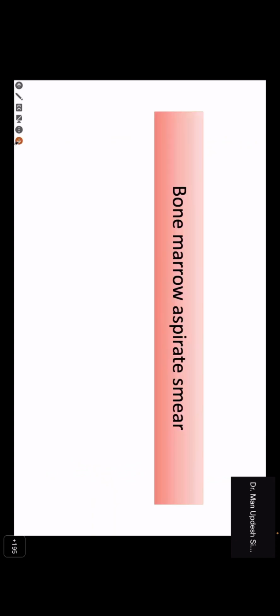Just to summarize the picture, there is a leukoerythroblastic picture in this patient. We move to the bone marrow aspirate, because the differentials of a leukoerythroblastic picture with leukopenia at this stage have a lot of causes, malignant as well as non-malignant. So let's see if Tarun Jyoti can come in here. The patient is 60 odd years.